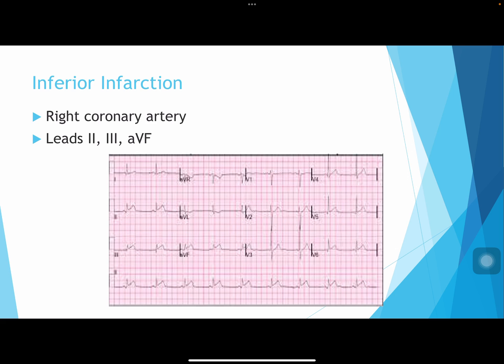Fifty percent of these patients actually lose their criteria for significant Q waves. Whatever happens with infarctions, 50% of the patients will keep those Q waves like we talked about with the standard MI. In others, that Q wave falls off for whatever reason. So that's just something to know.